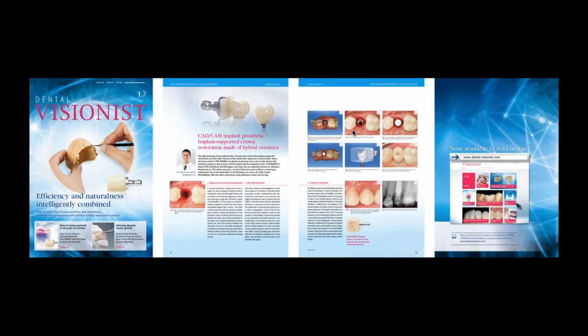Then I can place the ScanPost and send the patient to make the x-ray. And once we verify that the ScanPost is fully inserted, then we go ahead and make the second scan with the ScanPost to capture the position of the implant. But that will always be my second scan. The first one will always be the soft tissue and the proximal areas of the neighbor teeth.